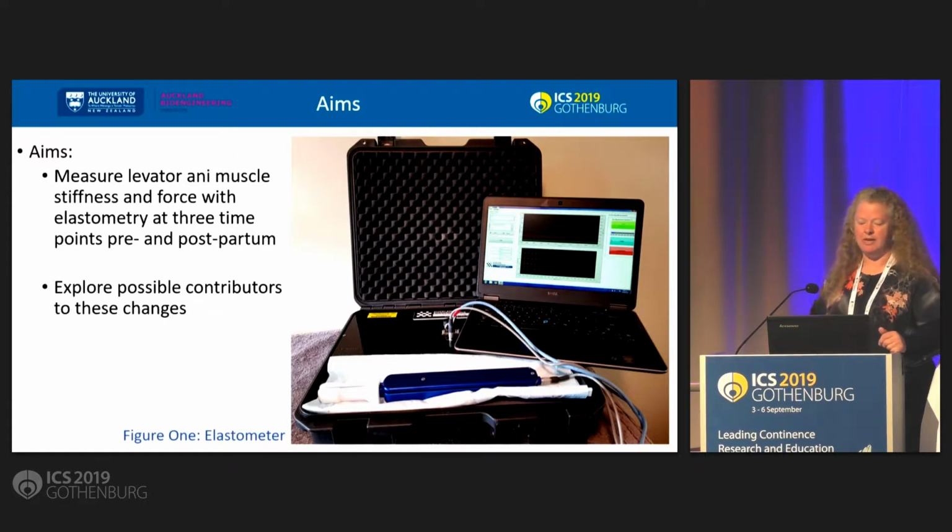This is to measure levator ani muscle stiffness and force with elastometry at 3 time points pre and postpartum, and to explore possible contributors to these changes.